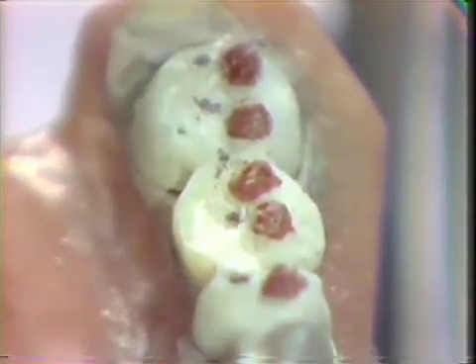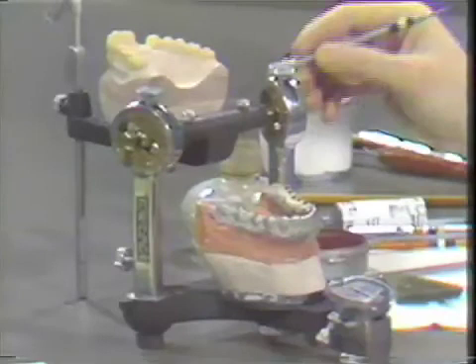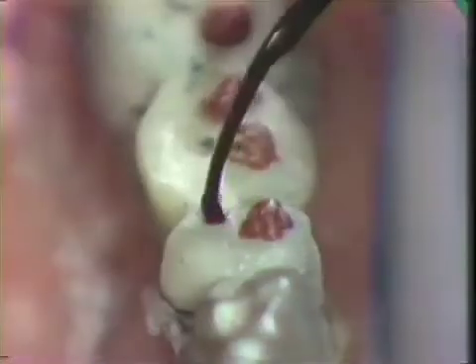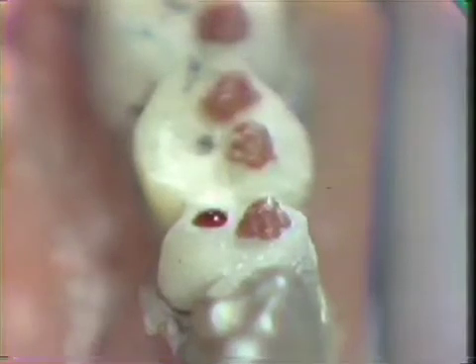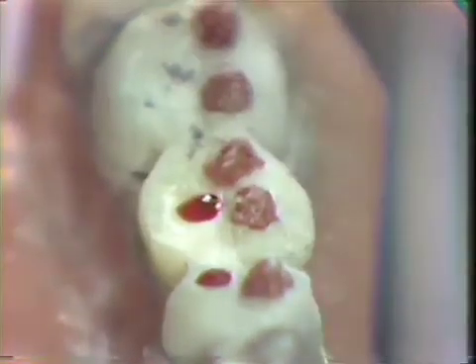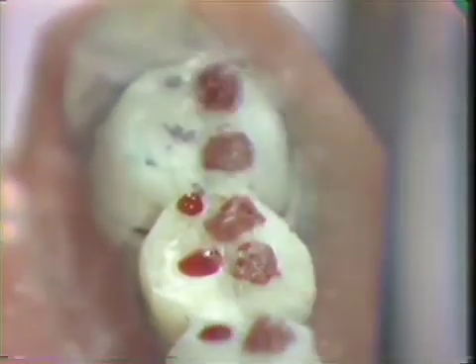And now, again with Peter K. Thomas waxing instrument and some red wax, we will develop these centric stop areas on our mandibular platform. We're using a little template here, or platform, if you will. In a clinical procedure, you may use one of these, or you may have just a skin of wax over the dies.